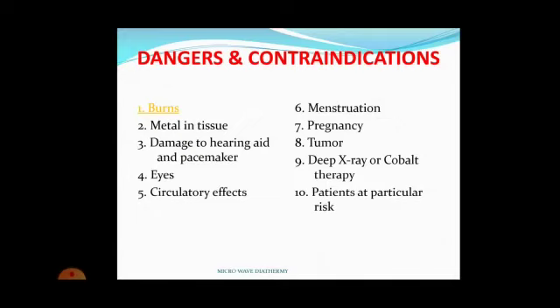Many times the patient does not report overheating because of impaired sensation. So before giving microwave diathermy we should check the patient's sensation, and if we find that sensations are impaired, then we should take care of the intensity. We should not give more intensity even if the patient requests it, clear.